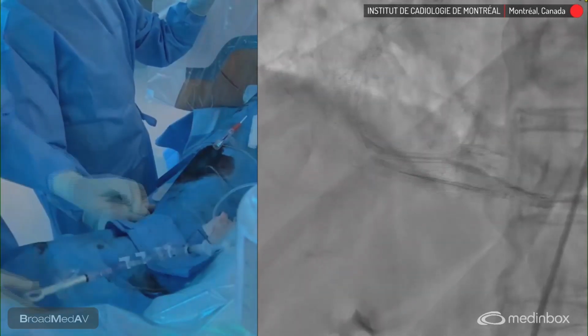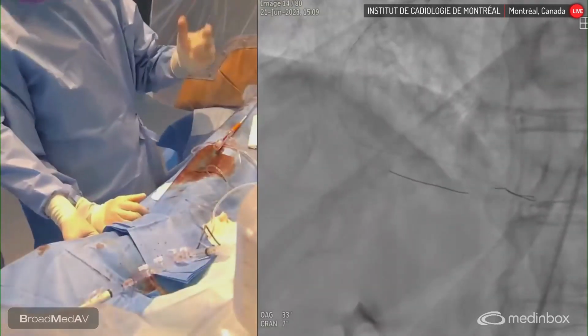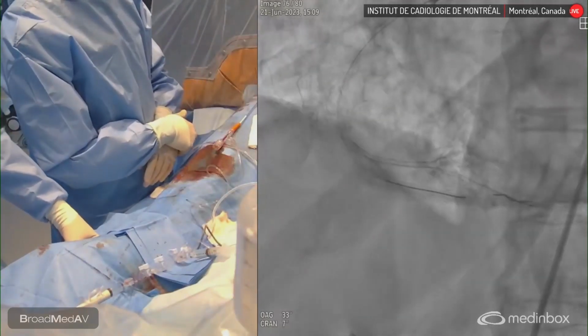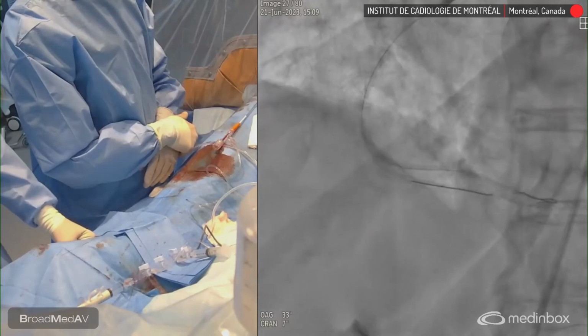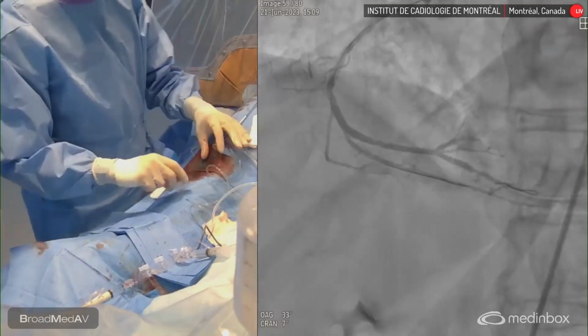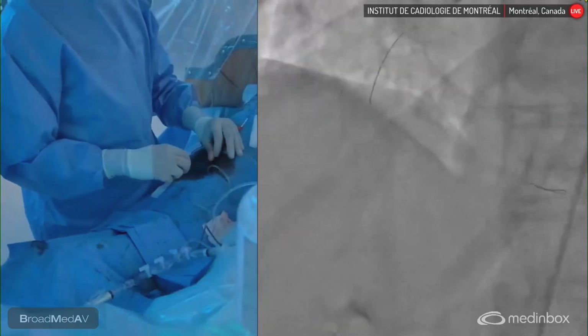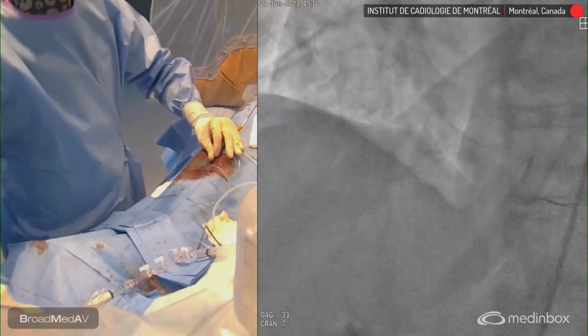All right. Probably a bit pinched, but I wouldn't do dual stent strategy here. I think this is actually pretty good, Mohamed. Yeah. So let's take the 30 by 38. I'll remove this wire. Very important not to jail a wire on two stents if you don't want to have any lost tips.